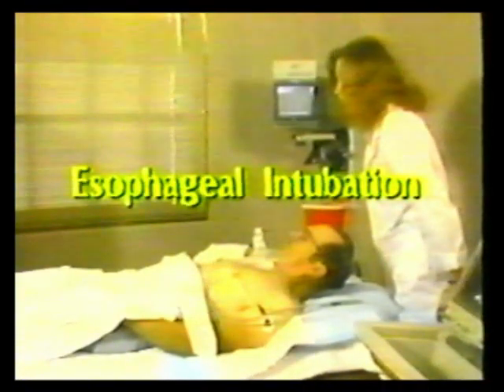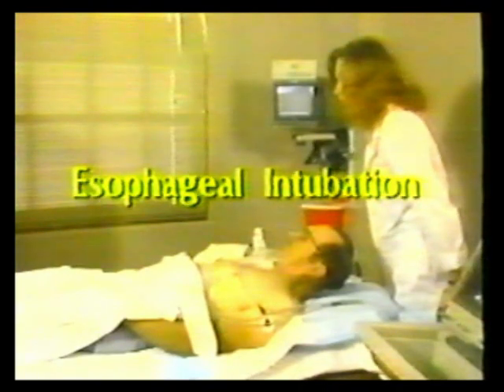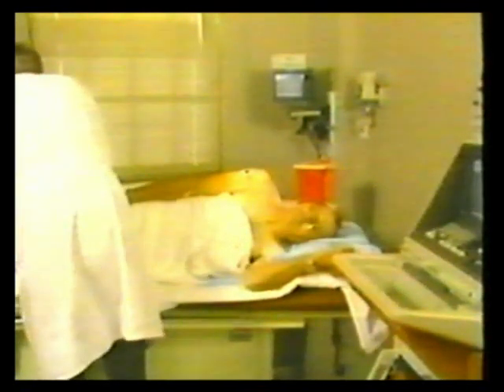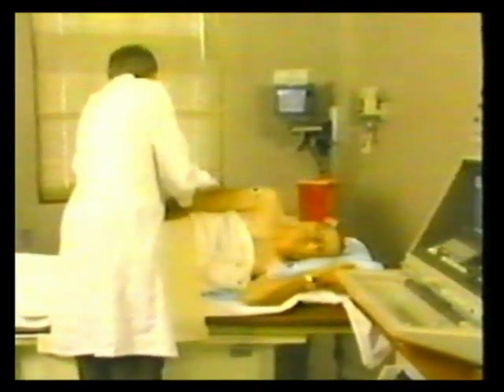This segment illustrates esophageal intubation in the outpatient environment. The patient is rotated to the left in a decubitus position. Comfort is obtained, both warmth as well as a supporting pillow behind the patient. Usually the upper leg is positioned anterior to the lower to assure that the patient remains in the decubitus position. A minor securing restraint assures the patient will stay in the left decubitus position.